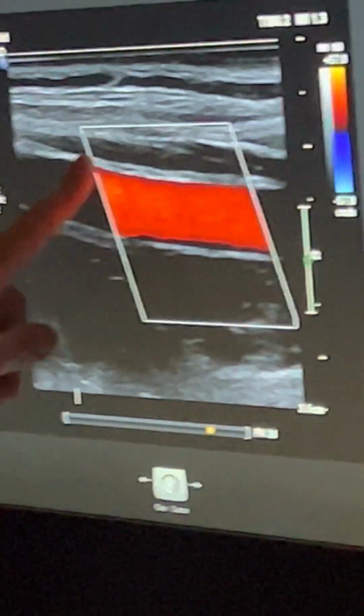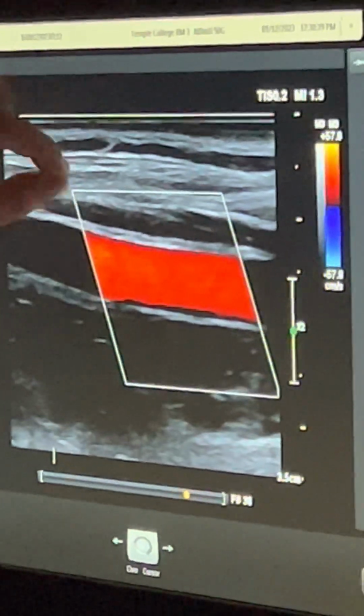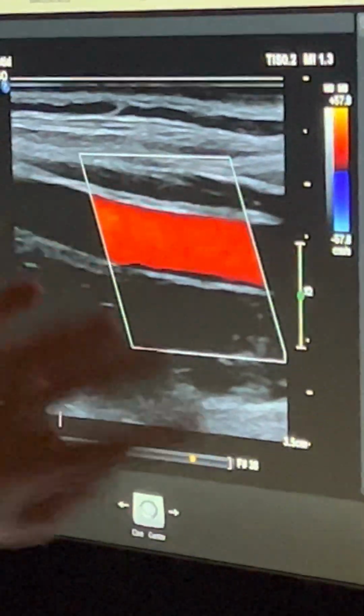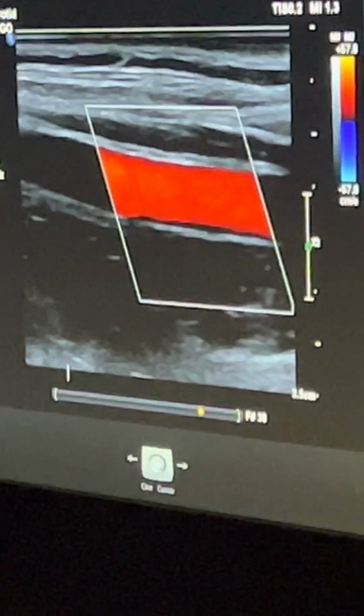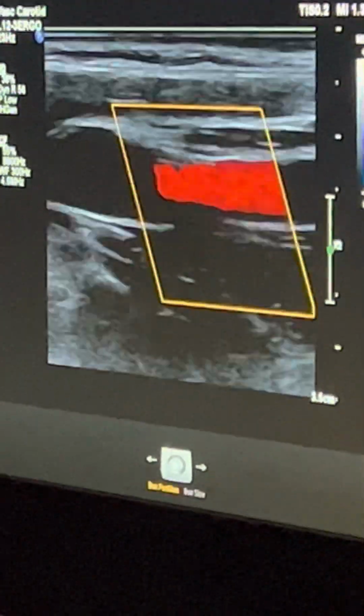The box, I have it angled as well. Do you see how this comes to a more dramatic point than this edge here? Okay, that's what I mean when I say point your box towards that vessel. That is pointed the direction that vessel is going.